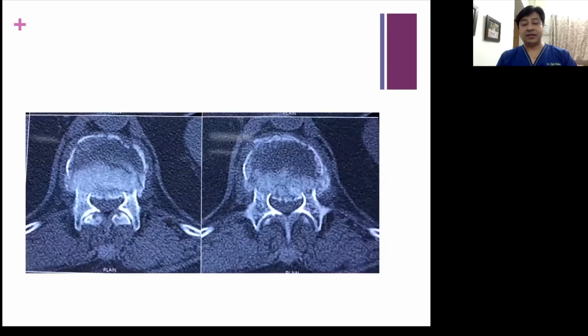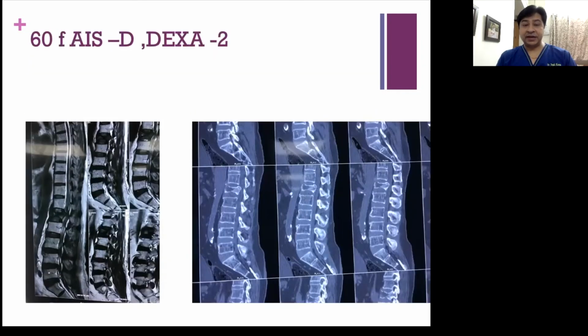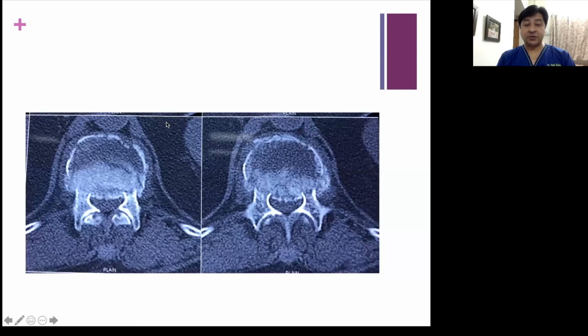Now look at a completely different entity. Again, a thoracolumbar fracture, but this time it's an osteoporotic thoracolumbar fracture, and you see there is a retropulsion again, and there is a big void anteriorly. Can we use the same principles here? Of course, you can use the same principles here, but you need to slightly modify them. And you can see there's a retropulsion and there's a big cystic lesion anteriorly.